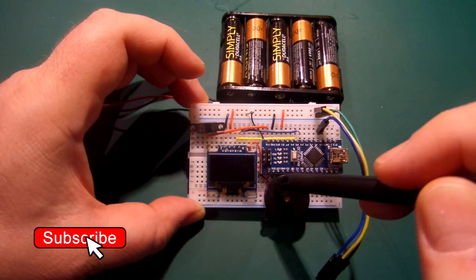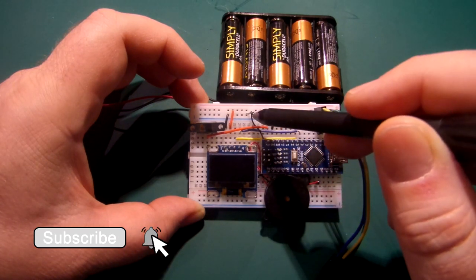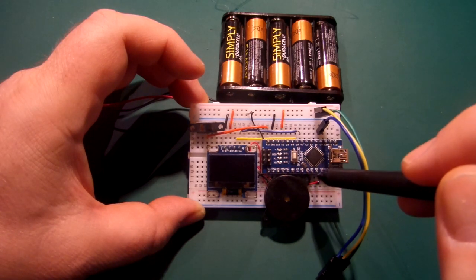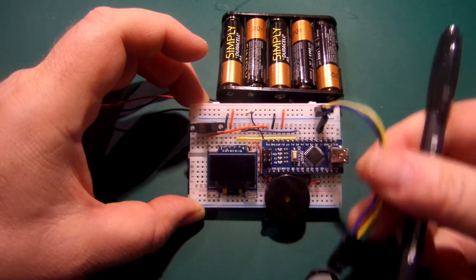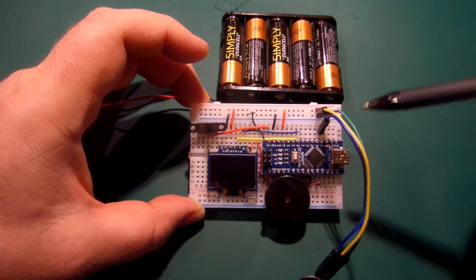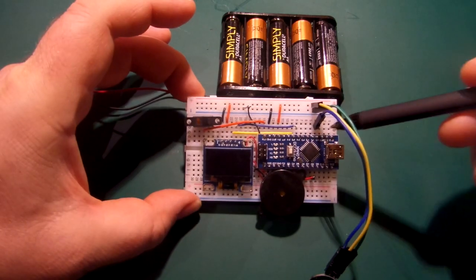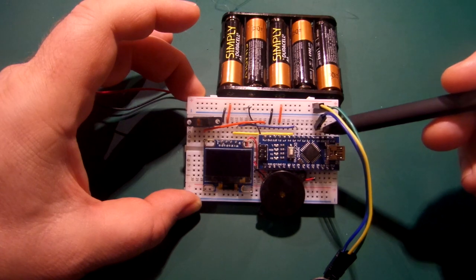Next, the little piezo sounder — the wiring just goes to ground, and the positive of the piezo is connected to D8 on the Nano. Now the heartbeat sensor itself — just takes power and ground, and the third connection, the signal pin, goes into A0, analog input zero of the Arduino Nano.